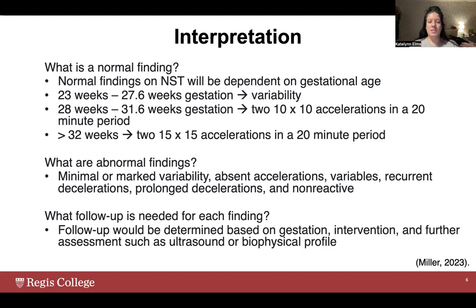It could mean that the fetus is having a normal sleep pattern. Babies usually sleep in the womb as well for up to 25 minutes. So that could mean we need to give mom juice or something cold or turn her or use vibroacoustic stimulation, which at all the hospitals I've worked at, I've never actually seen a true device for this. We usually use a vibrating razor we use to shave patients for C-sections, and we'll buzz the belly.